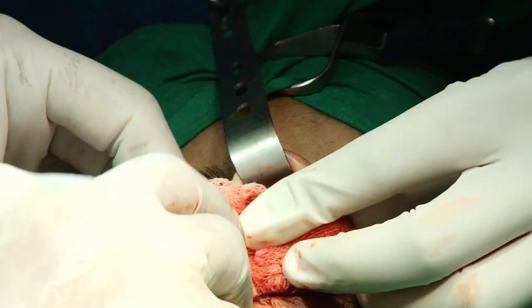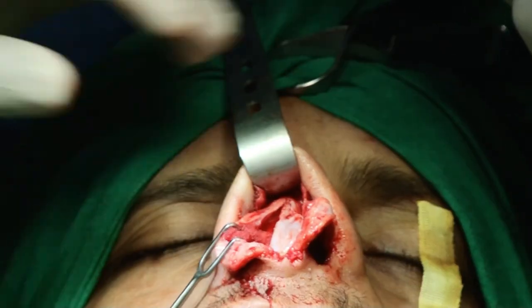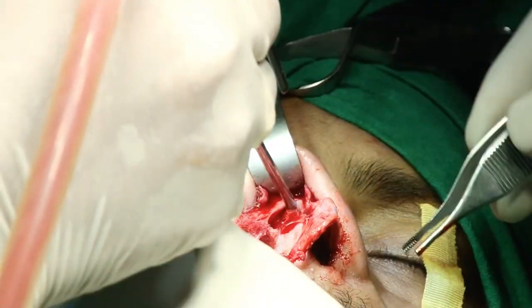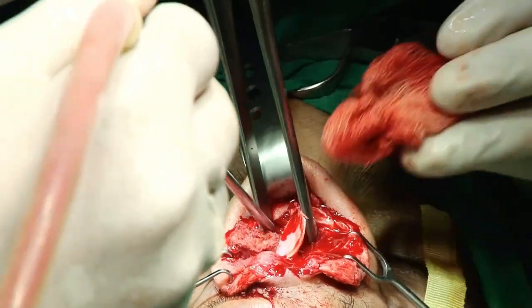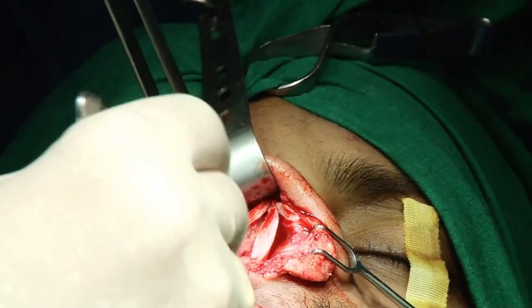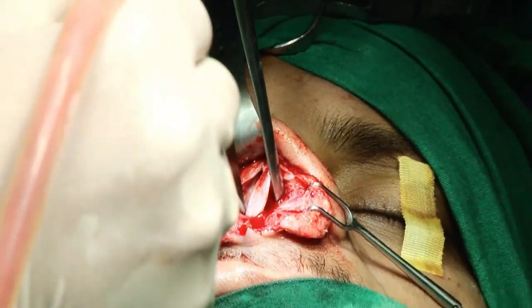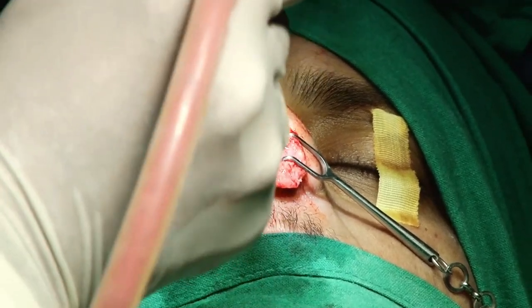2 and 3. Wait for the projection of the nose tip, 3 millimeters. I checked the projectometer. Wait. Yes. Increase projection of the supratip area. Okay, for 2 millimeters, projection of the dorsum in the radix area.